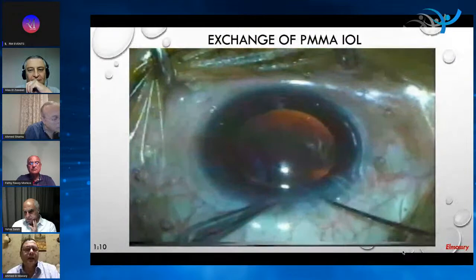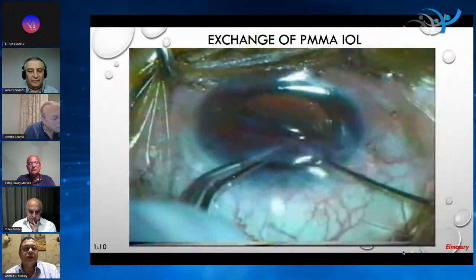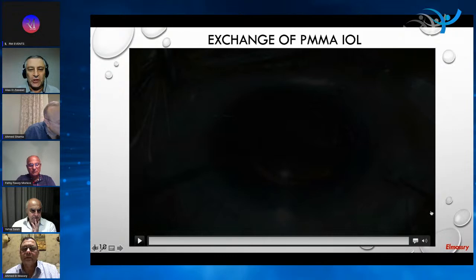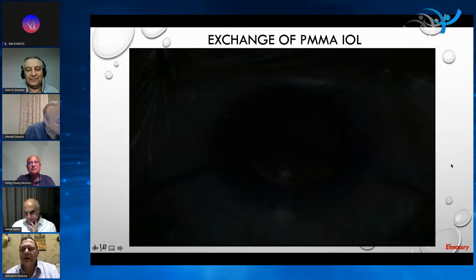But there are other causes of IOL exchange, with different periods or different times after the surgery. Here you can use viscoelastic, even to put the IOL in. One point: viscoadhesive, not viscocohesive, to protect the cornea. Viscoadhesive, yes. Sure.